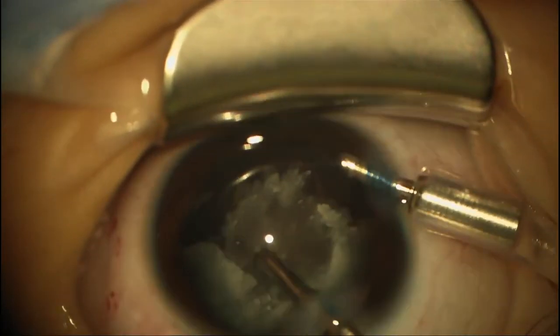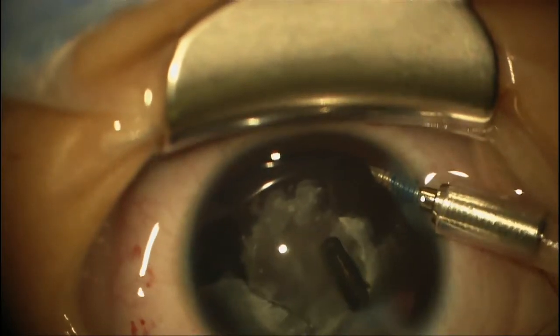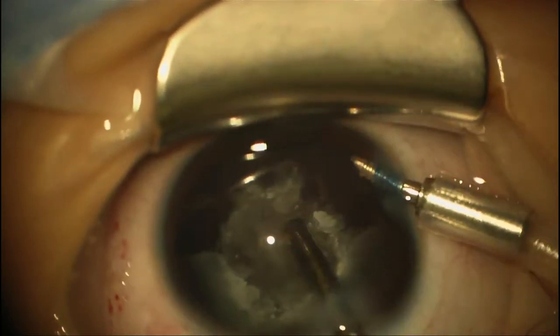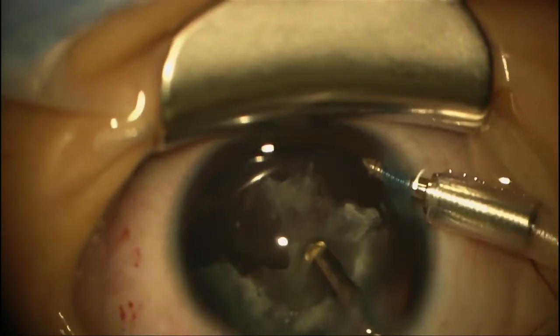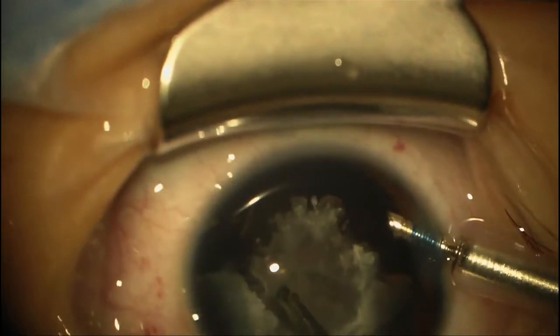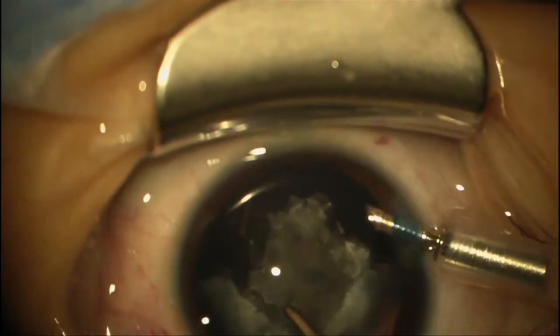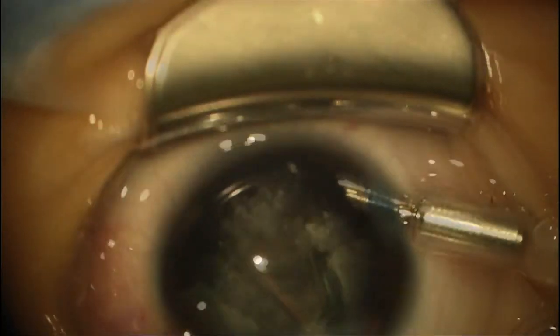Here's the lens nucleus — you can see the sutures in it. We're at the posterior suture here of the nucleus. And again, you can see this is a really deep eye.